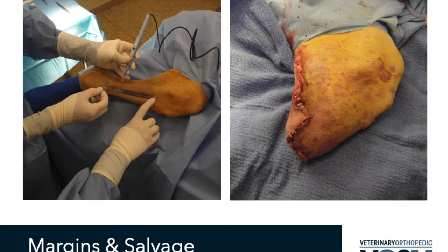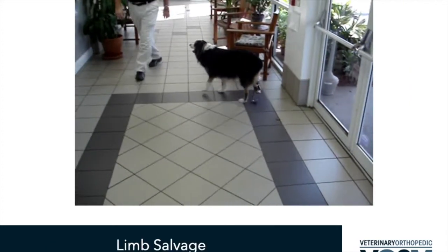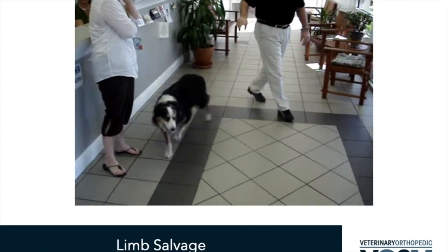We need to make sure that we plan this appropriately, that we leave enough soft tissue, A, for the closure of the wound of the surgical site, but also to make sure we have soft tissue coverage that is adequate for the application of the prosthesis. So in this patient's situation, the procedure was performed, and now you can see we have a compressive wrap on there, again, trying to decrease any swelling, edema, bruising, drainage that could come from that site. If we don't stay on top of that, it takes us longer to be able to get the prosthetic onto the limb. So here's an example of a patient that had a partial hind limb amputation.